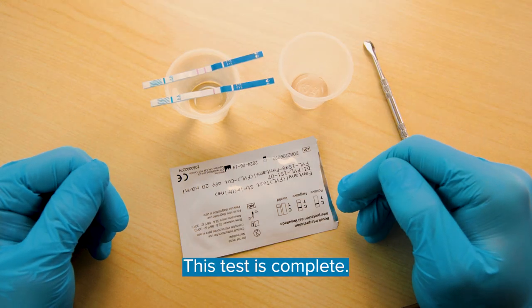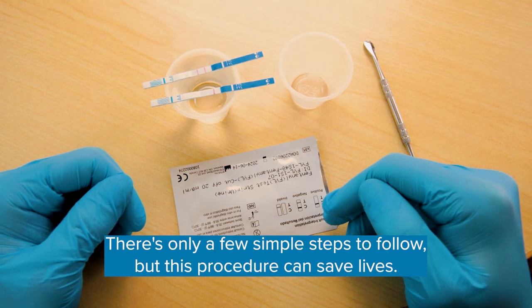Make sure to dispose of any used materials and wipe down your tools as well. This test is complete. There are only a few simple steps to follow, but this procedure can save lives.